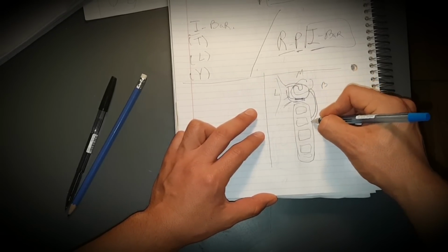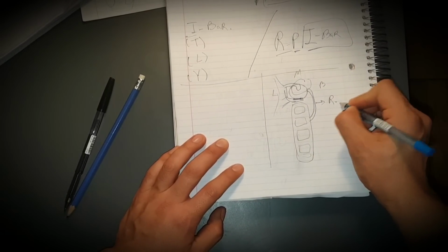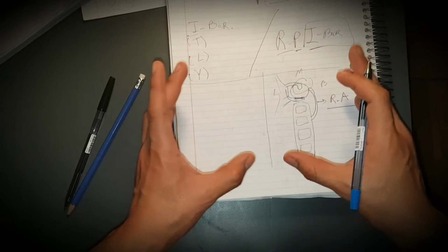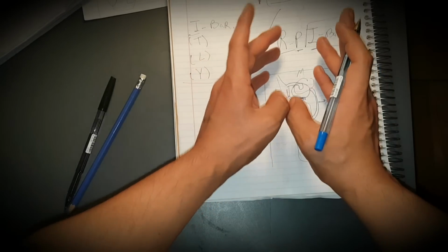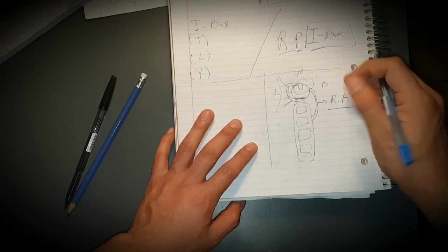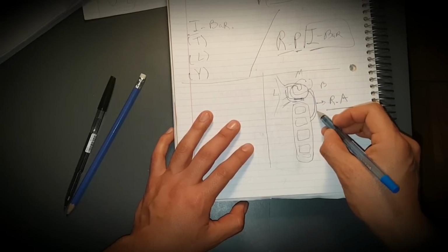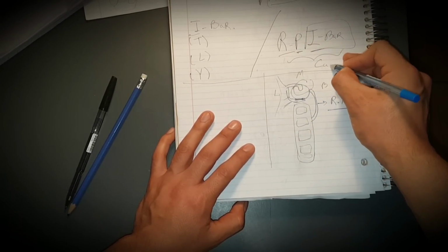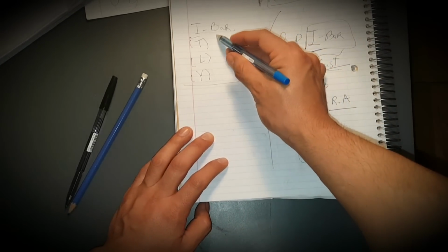So what's the I bar? This would be the retentive arm, like the cast circumferential that we saw, and we cut it into pieces. So the only thing I'm changing here is the retentive arm. The retentive arm comes from the saddle, but it is cast. So the RPI is cast. All the material is cast.